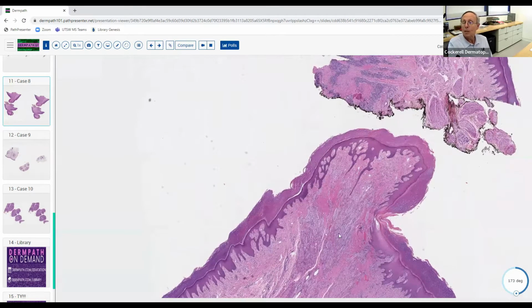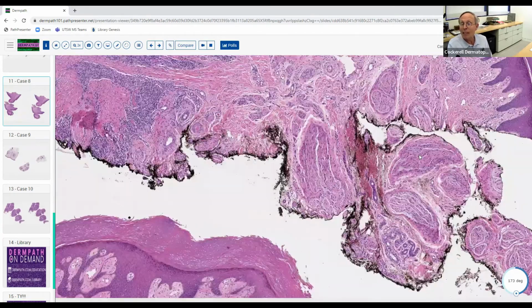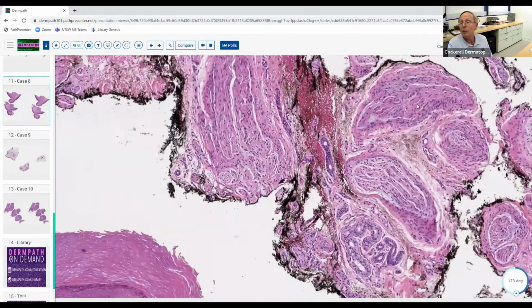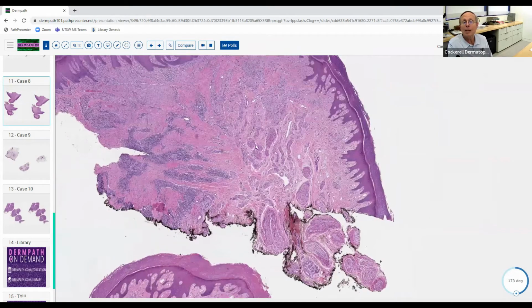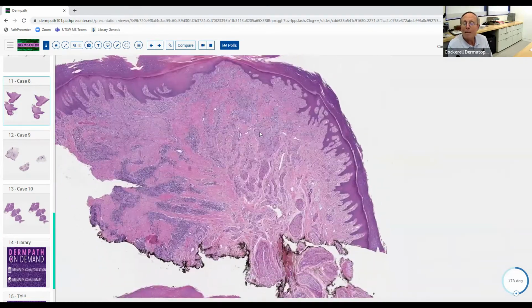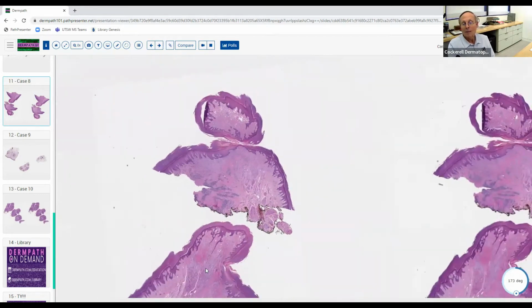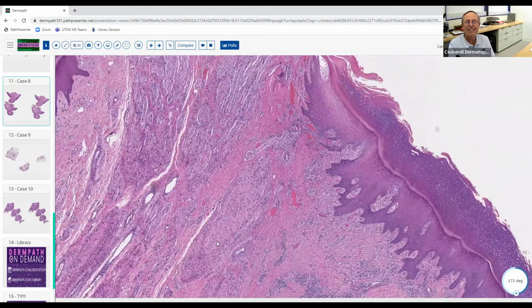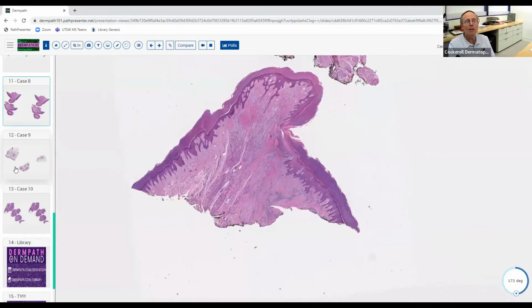When you biopsy it, it's basically a traumatic neuroma. And so this is a traumatic neuroma that really arose at the site of an accessory digit. This is nice Wallerian degeneration over here. So this is basically what happens in an accessory digit. It gets amputated, and then you just end up with a little papule that, biopsied, shows features of a traumatic neuroma. So good. Everybody, you'll never forget this one again either. Pretty cool. Those are not all that uncommon.